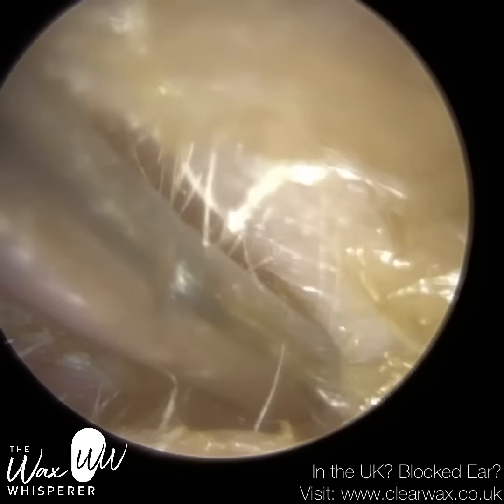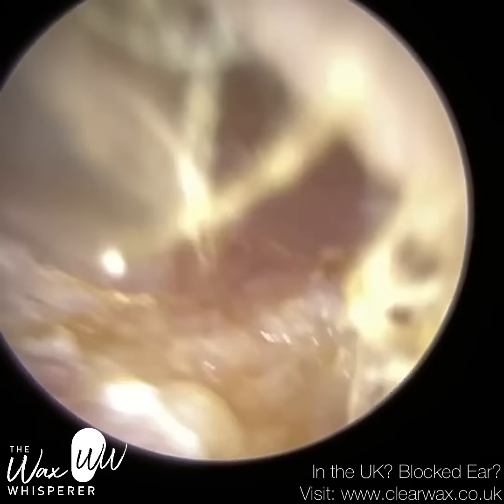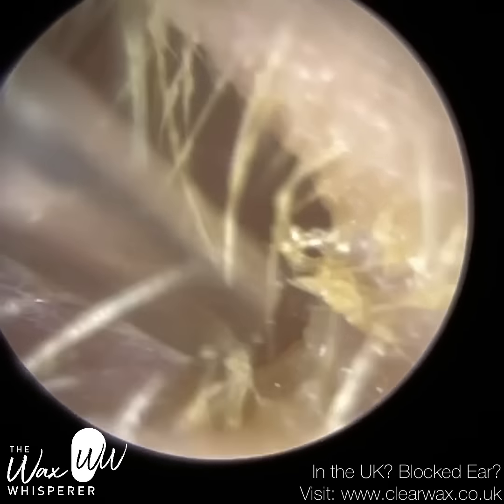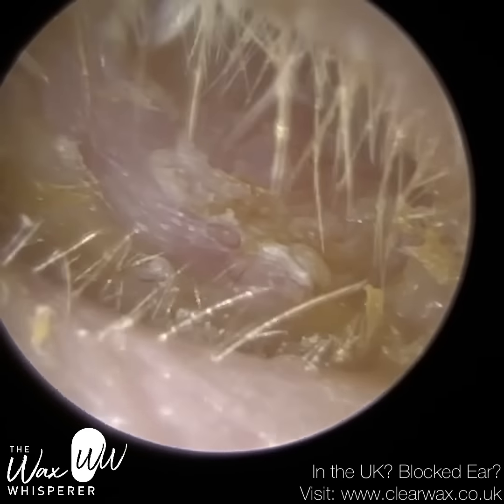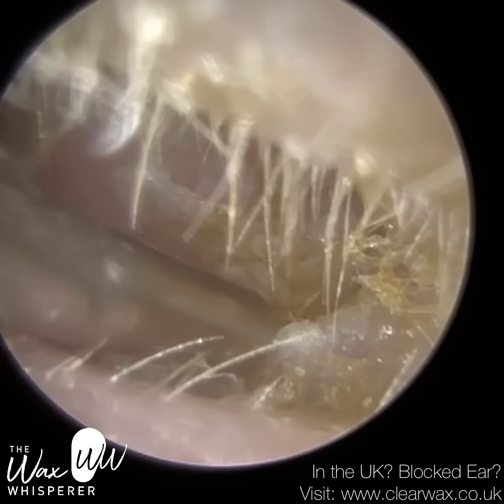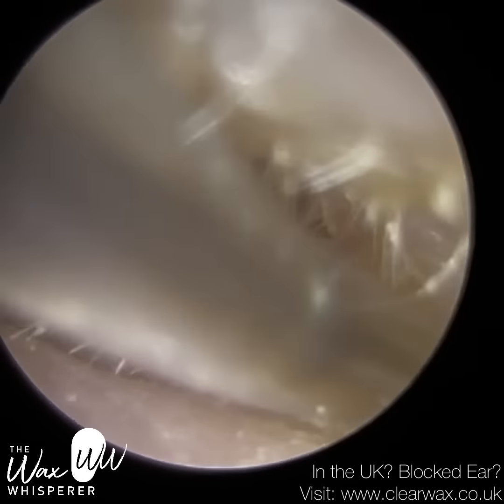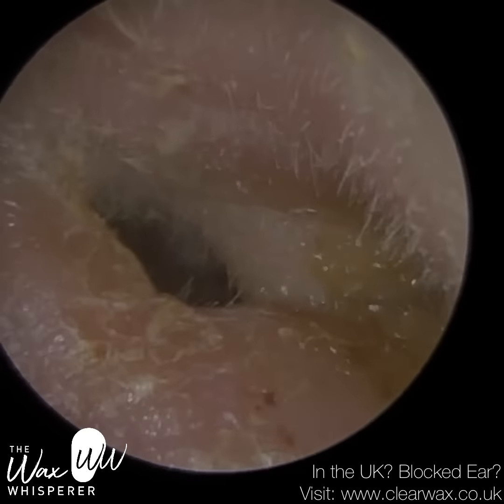So the patient does live alone. I've asked the daughter when they go back home to check her pillowcase, because I suspect there's going to be a lot of discharge on that from the right side when they're leaning over, if they do sleep that side, of course. So all the discharge, all the moistness and dampness in the ear causes the skin to die and become soggy. We're just trying to remove as much as we can.